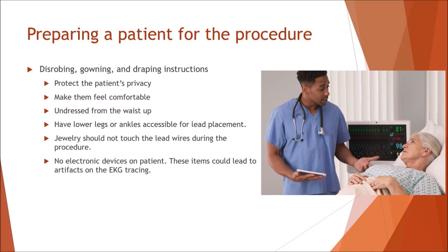Because of where the electrodes go, you always want to protect the patient's privacy. It can be tricky at times, but once you start doing these procedures more and more often, you find little ways of doing it. It is not always necessary for the patient to completely disrobe. Obviously they don't have to take their pants off, but you do want to have access to their ankles, so they might have to roll up their pants.